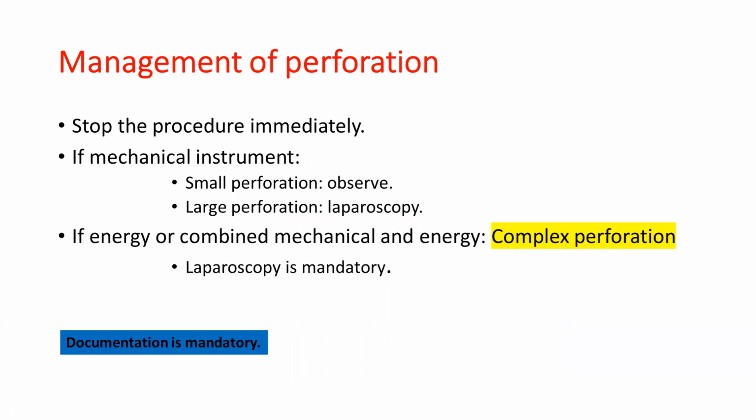How to treat perforation? You have to stop your technique immediately. Don't proceed because of the collapse of the field; you don't see what's after this perforation and what organ has been injured by it. If you are using just mechanical instruments, scissors, and it is a small perforation, you can observe her without indication for laparoscopy. If it is a large perforation, laparoscopy is indicated to control bleeding and to check the organs.